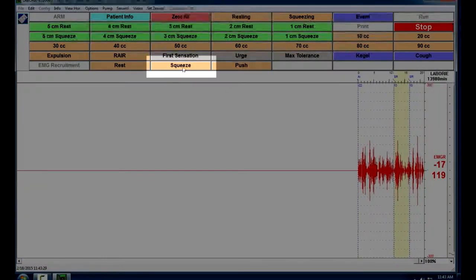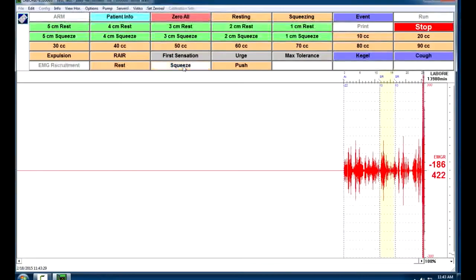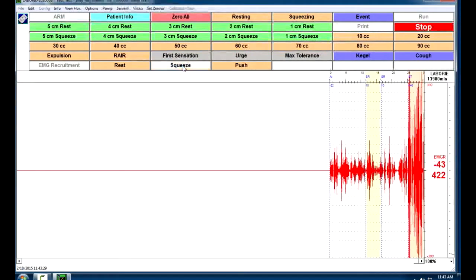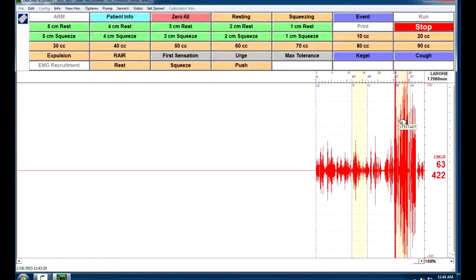Then we're going to ask the patient to squeeze their anus like they're trying to prevent gas from being expelled. So you're going to squeeze. You should see an increase of the EMG like that. And then once that's done, you can see the changes in colors.